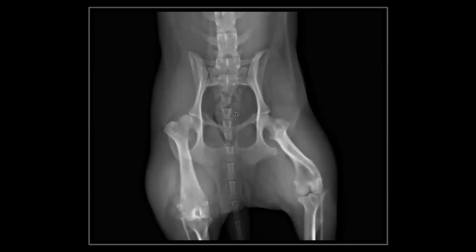So this is not the greatest, but not a bad shot of the pelvis. This is unusual, because we have asymmetrical disease. We have a pretty good looking hip here, with pretty good femoral head coverage, a nice smooth femoral head, and the acetabulum dorsal rim over here. And here we have what is likely subluxation of the femoral head, very poor coverage, not a lot of secondary signs, but early secondary changes to the hip joint.